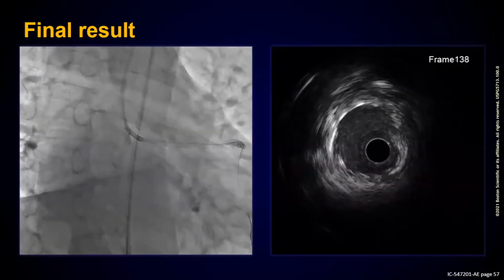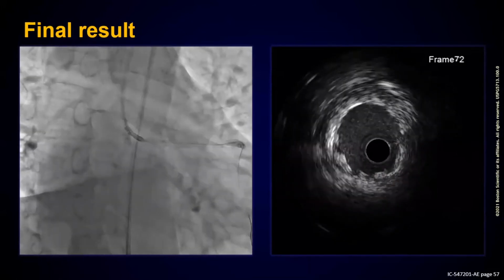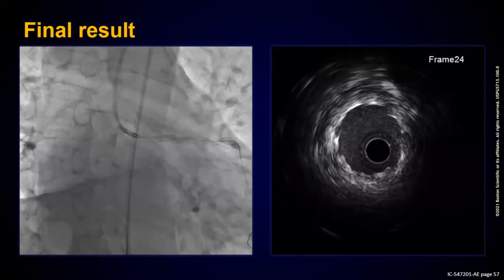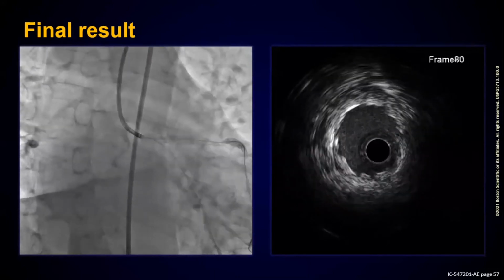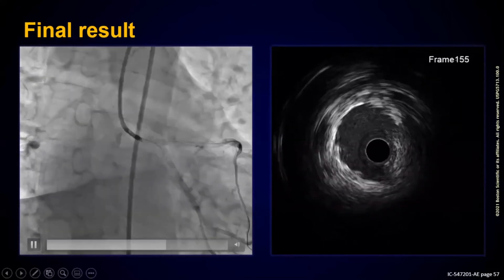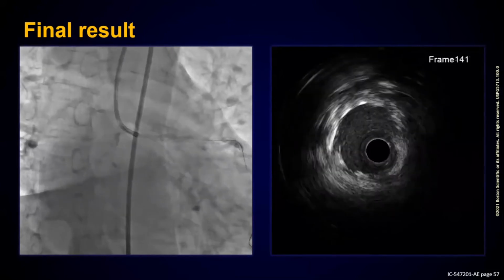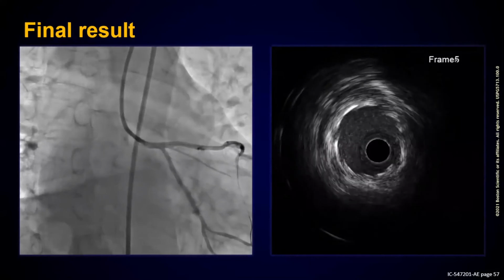Sorry to interrupt, but did you do IVUS into the ostium of the circumflex? The reason I ask is that I don't do a TAP for bifurcations. I don't know whether it's just because I've been brought up on more contemporary technique, but for this type of lesion I would always do a Culotte or a DK crush, just because I'd be so concerned about missing the ostium.